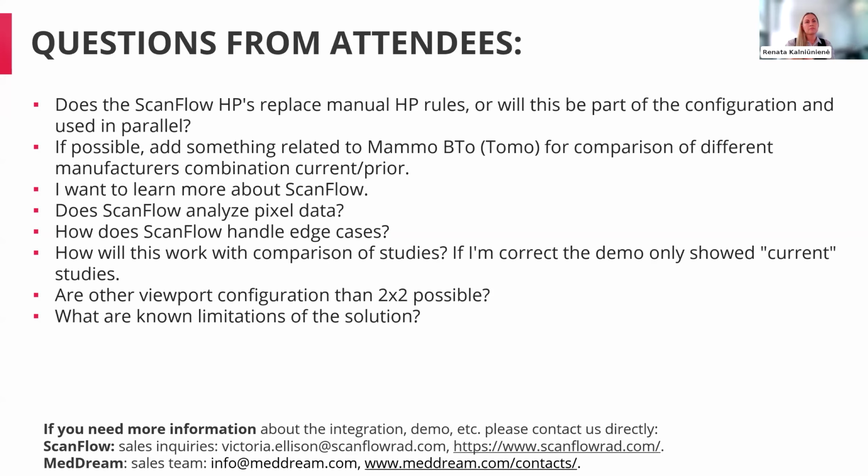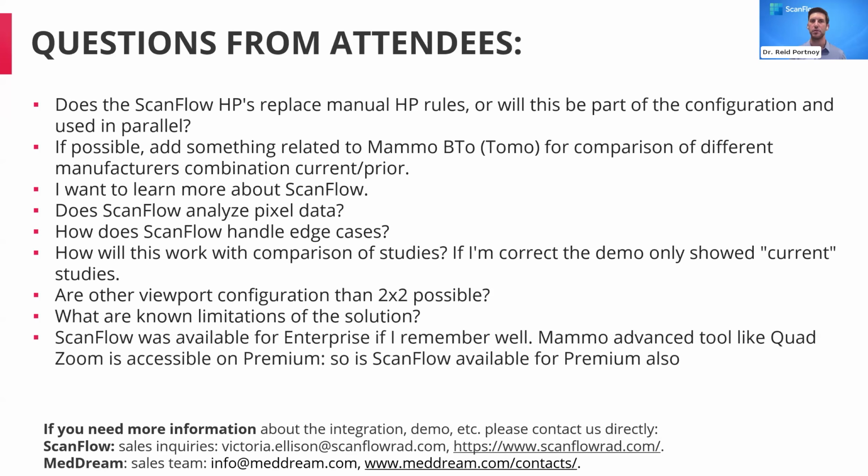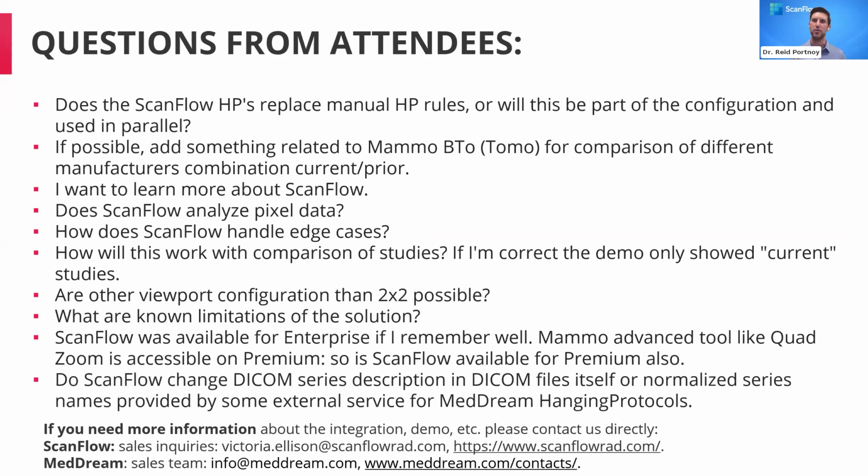Okay, thank you. Another one. Does ScanFlow analyze pixel data? Yeah, this is a great question. ScanFlow does not utilize pixel data. We work entirely through DICOM metadata. So ScanFlow runs on a CPU infrastructure, and there's significantly less data processing, which keeps the solution lightweight, fast, and avoids any regulatory processes associated with image analysis. Also, because of this, we're not hindered by any artifact that may be on the image, whether it be from patient motion or metallic artifact, etc.